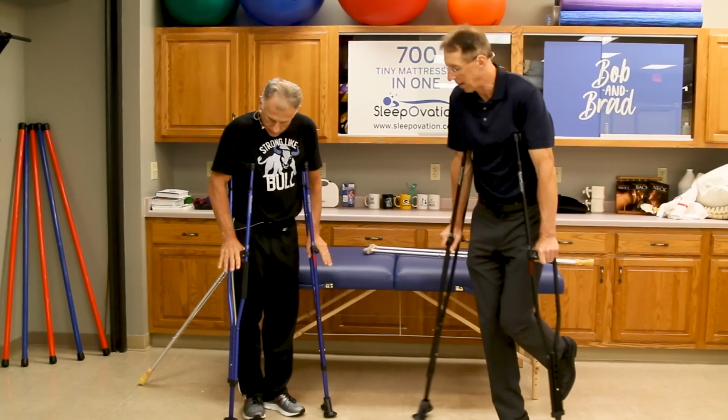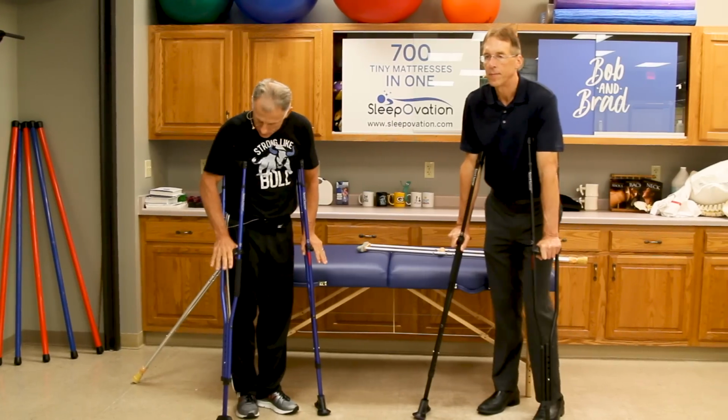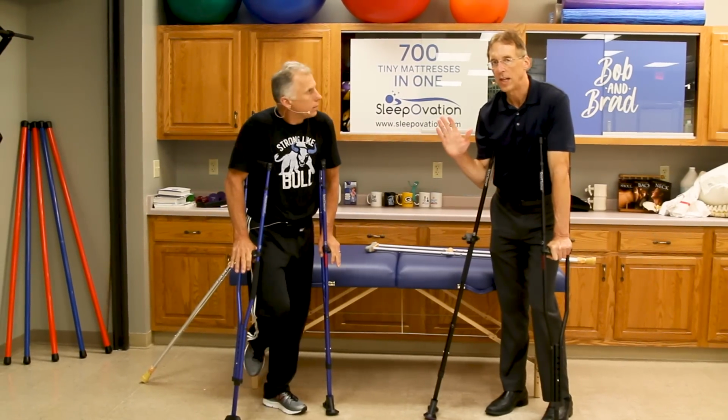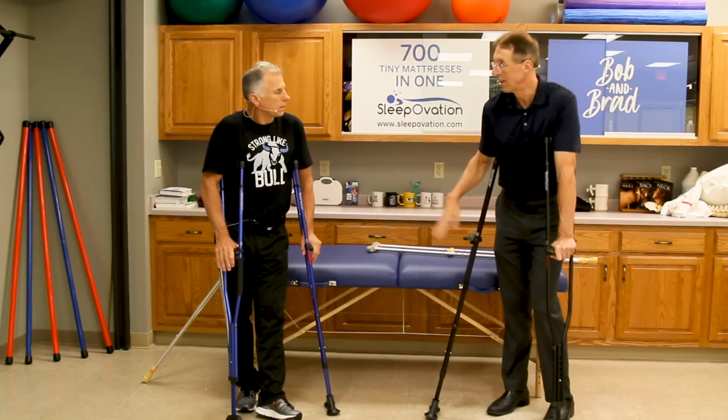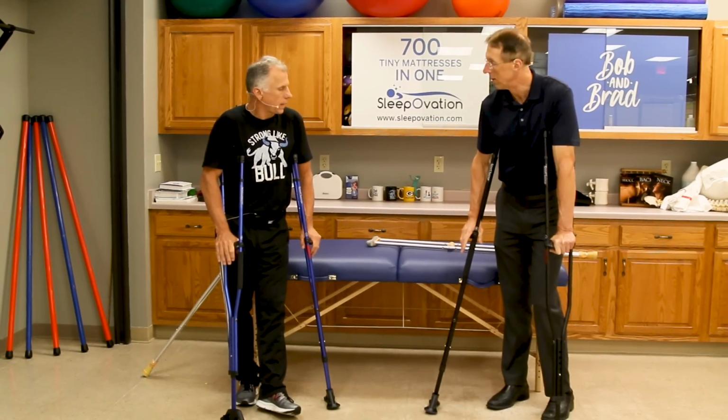Yeah, it's going to be nice on the hands. So they fit right in. You don't really have to grip. You have a natural V of your hand, so no matter what the size of your hand, you have a V like this, and it's going to fit well. Yep, right into the palm.